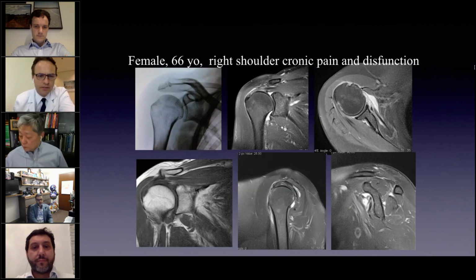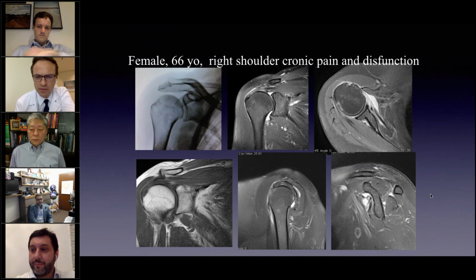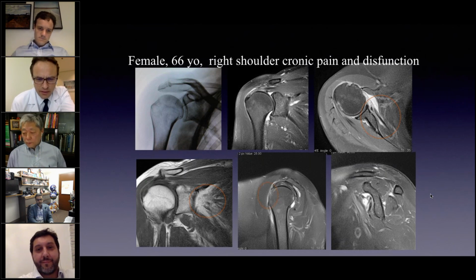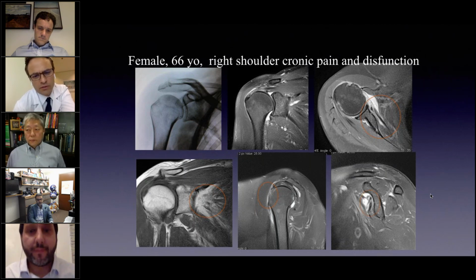We can see here on her X-ray, it's a quite normal X-ray with a quite normal supraspinatus, a very large subscapularis tear with a long tendon, meaning probably there is a chronic disease on subscapularis and subsequent tear with degenerated belly. Look, the anterior wall of the rotator cuff is gone, and so the diagnosis is an irreparable subscapularis tear.